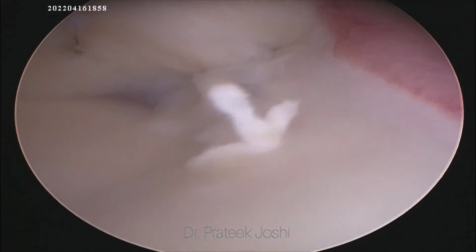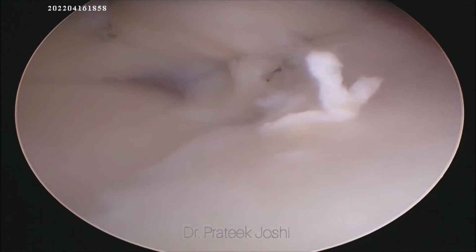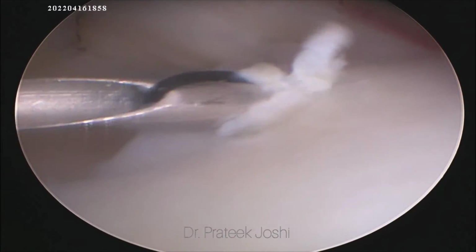Now for the radial tear in the body, we are going to use outside-in technique to pass the suture in horizontal mattress configuration.